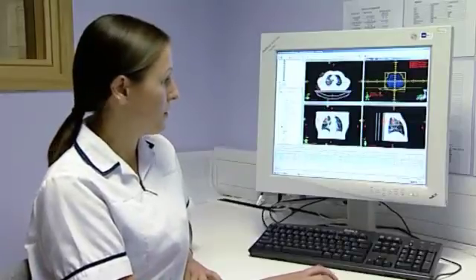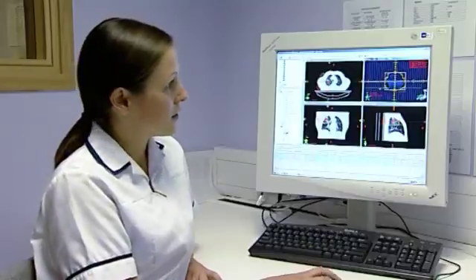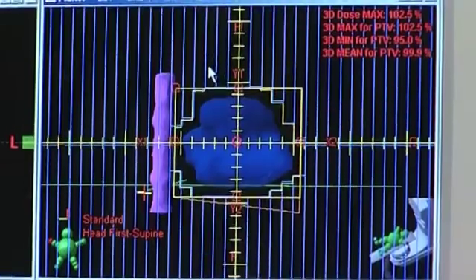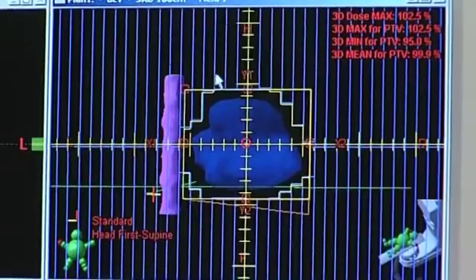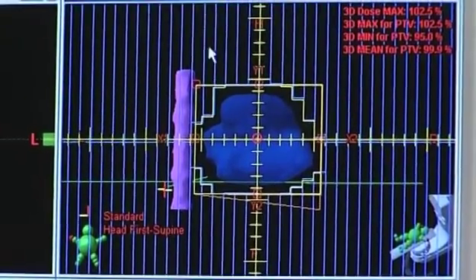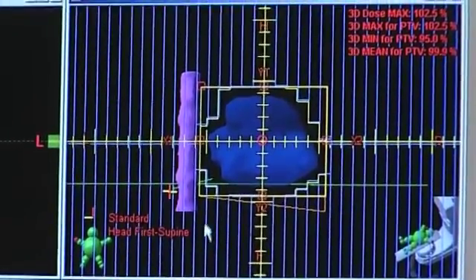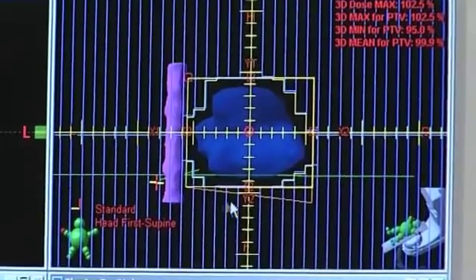As you can see here, these yellow lines and these blue lines represent the MLCs. These are one centimeter thick leaves that you can push into the field to shield out certain areas.